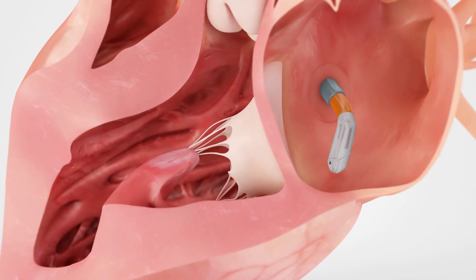The Cordart system is brought into the left atrium through a transfemoral, transseptal, and antegrade approach. The steerability allows the device to be precisely maneuvered to face the mitral valve.